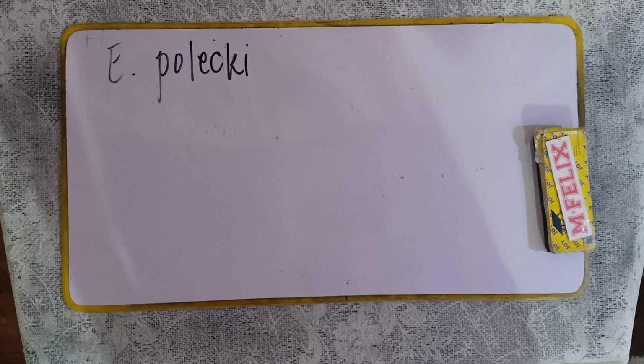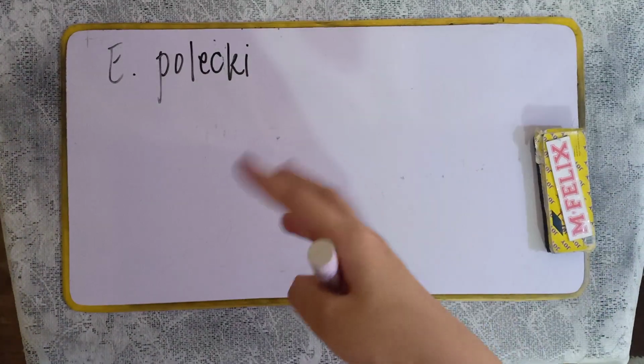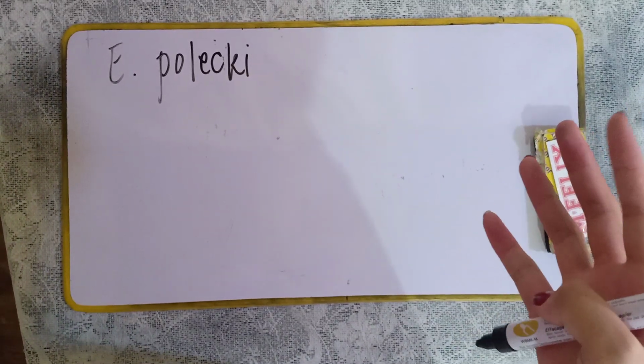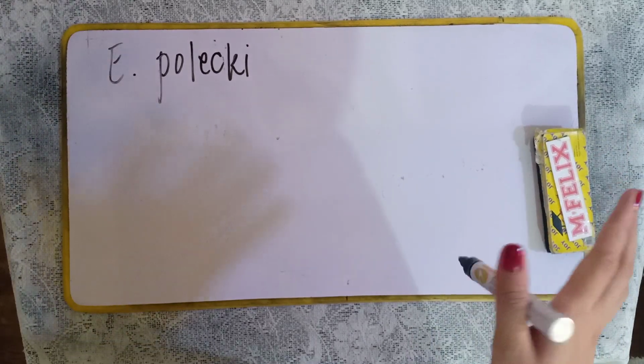And then next we have your Entamoeba polecki. This parasite is actually a parasite of pigs and monkeys. Okay? So, animal parasite yung mga yan. However, it can also be mistaken for E. histolytica, but may mga differentiations din.